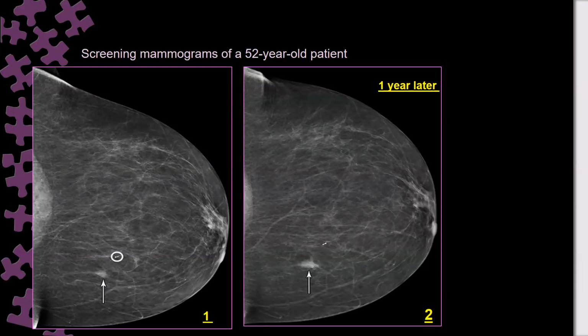It is in the original image, in both here. I said the original. So that means there is one image before this. This is what is available at the first one, but there is a previous mammography before this one you have seen here. Most likely there is either a biopsy or something, because this is a tissue marker.